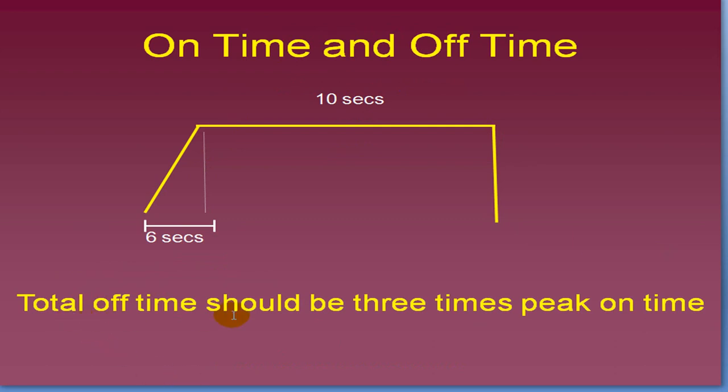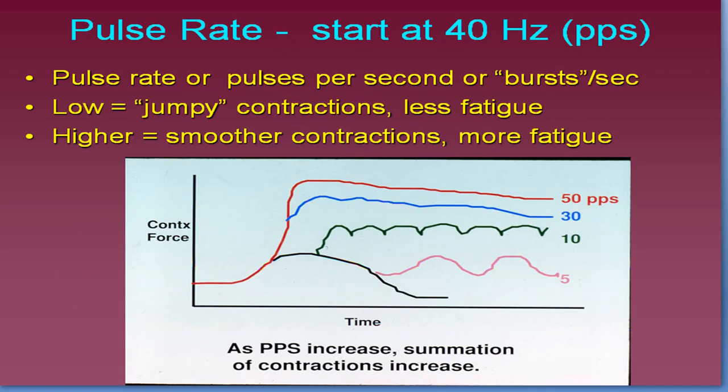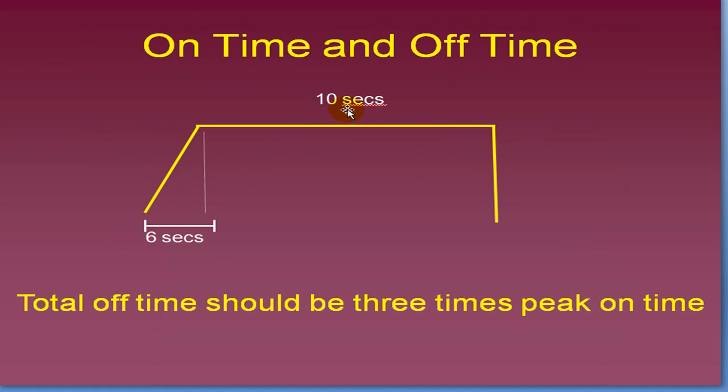So total off time, or total rest time, think about it as rest time, should be 3 times the peak on time. In this case we said 6 second ramp, 10 second peak. Our rest time would then be 30 seconds. And you can set those at whatever. This is totally up to you. This ramp time, on time, total on time, this is totally set up by you for whatever peak on time fits the activity that you have going on at that moment. You can have it for less. You can have it for 8 seconds. Just know that this is going to be up to you. It's a parameter you can set between you and your OT.